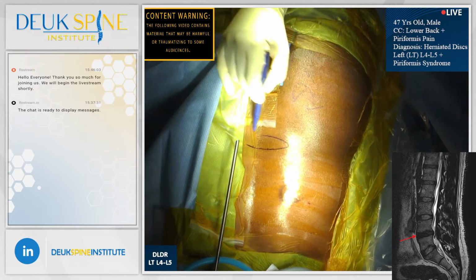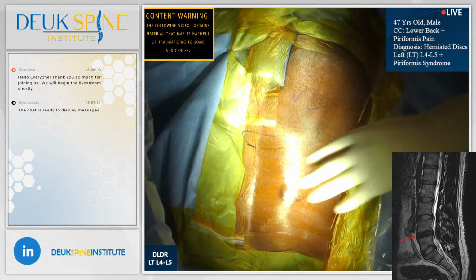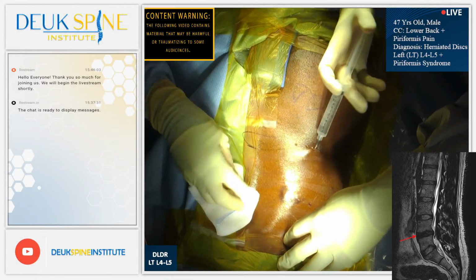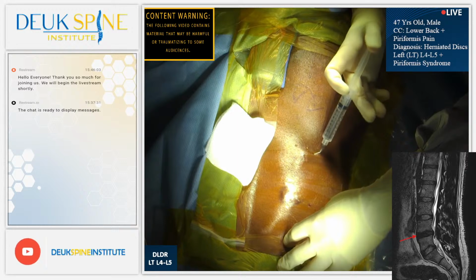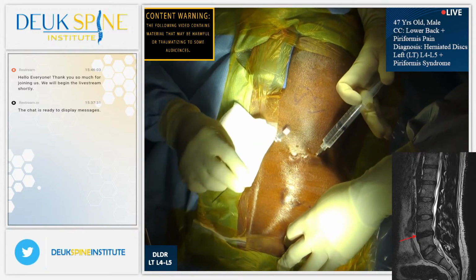All right, so let's get started. We'll do some numbing. We're going to give you some numbing medicine. Lay still, don't move, just a little stick and burn. Sorry about that. Our patient will be awake just for the first few minutes while we get started.